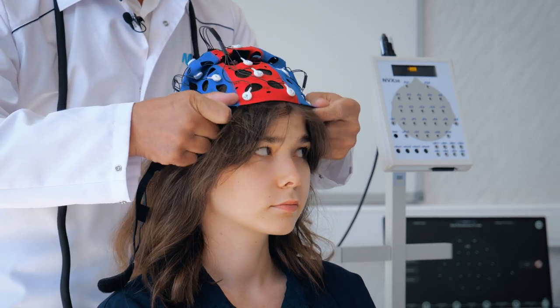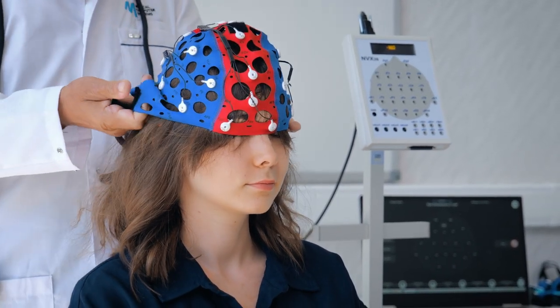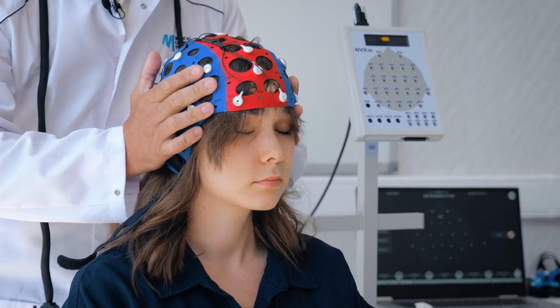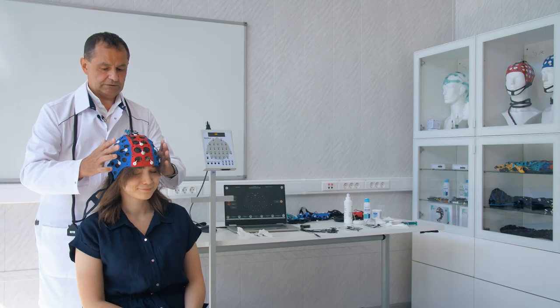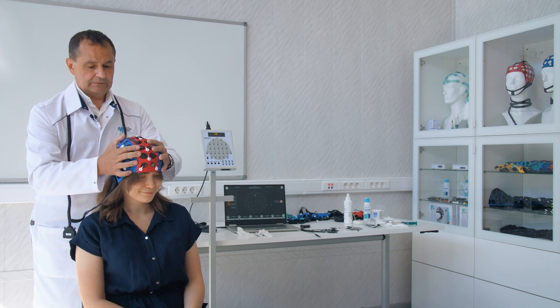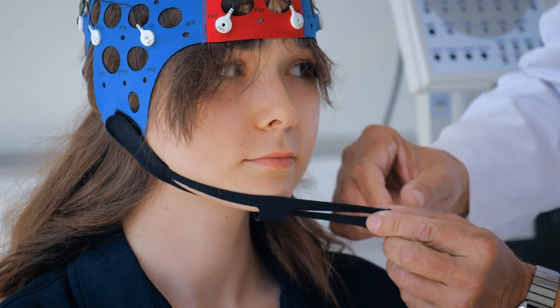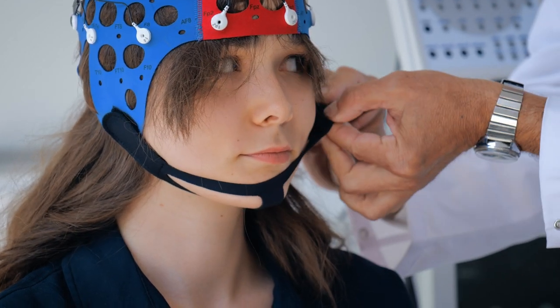We place the cap on in reverse, with caution. Without pulling the cheek part, we carefully put on the cap in a meticulous manner, making sure not to disturb any of its elements or misalign it in any way, and then rectify it by employing a chin strap to firmly fasten it in position.